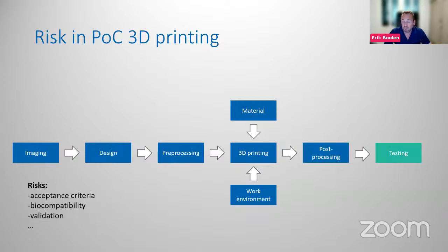And then testing. So what are the acceptance criteria for releasing a part? Is it still biocompatible after your processing? So I think validation of the whole process is quite important.